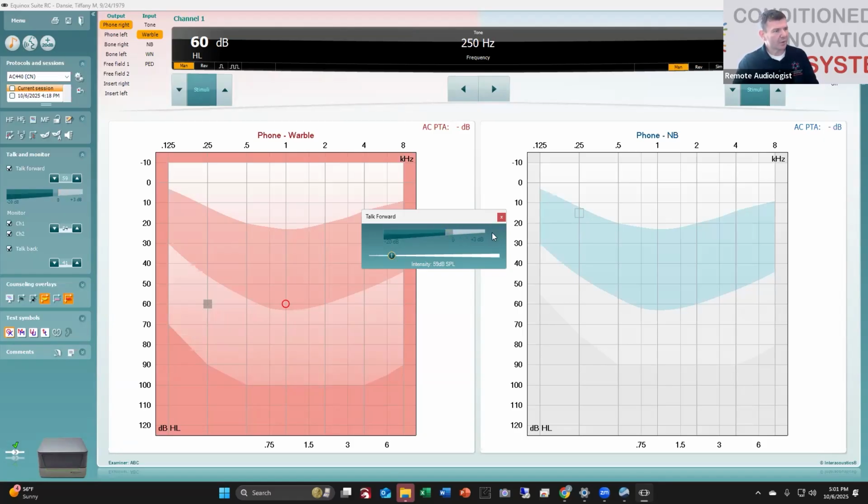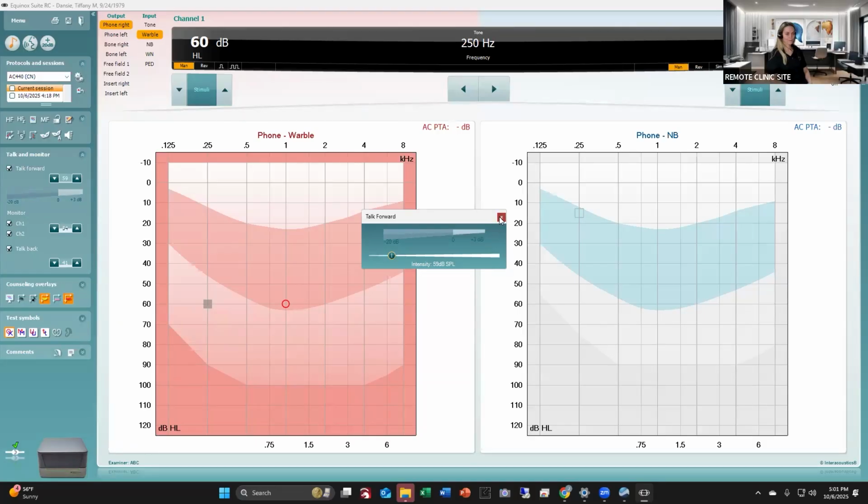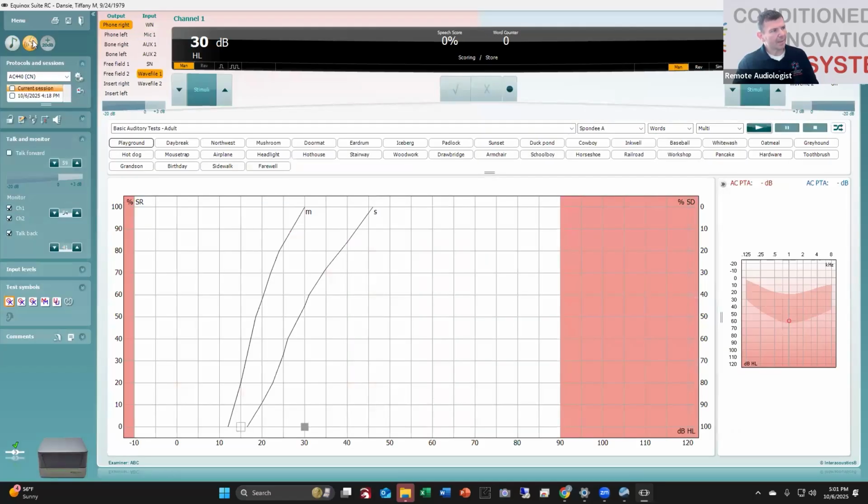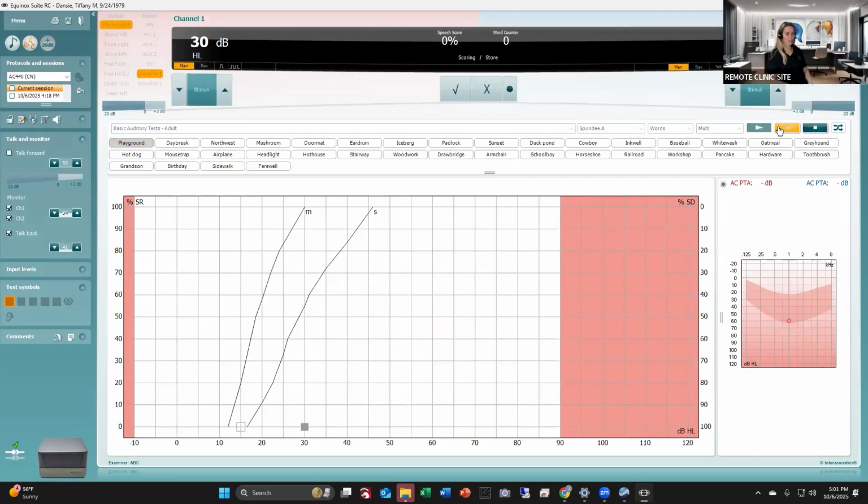I'm also going to play some recorded speech materials, Tiffany. You'll hear a few words, just repeat them back, okay? Okay, I'm ready. I'll navigate to the speech materials, and just for example here. Playground. Playground. Okay.